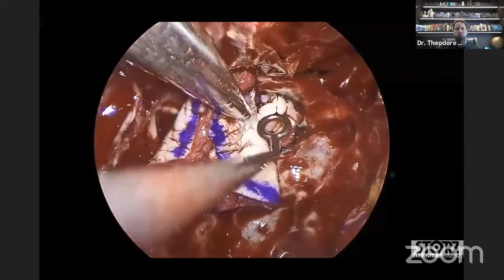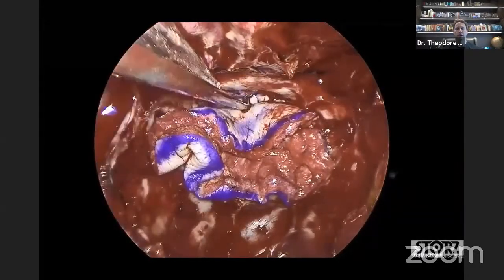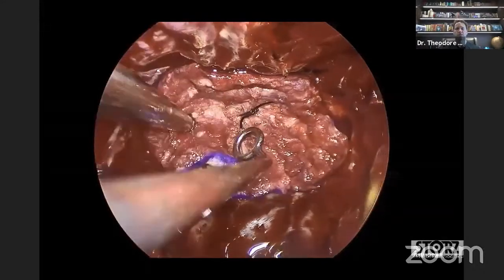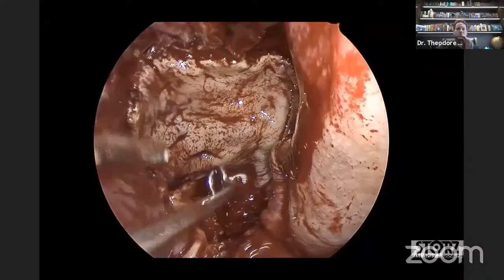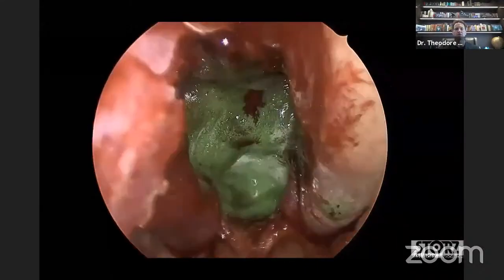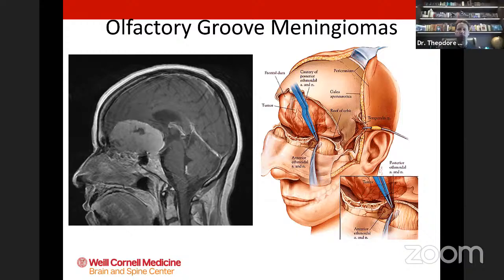This is something we adopted from Jefferson, from Evans. And you do an inlay onlay of these two layers of alloderm, and then you cover that with a vascularized flap. Sometimes we actually put fat below the flap. So we'll do the button with a little fat on top of it and then use the nasoseptal flap. And it seems to work very, very well. So although the gasket is a great closure, there is some risk of pinching the nerve, and we've been doing that a little less lately.